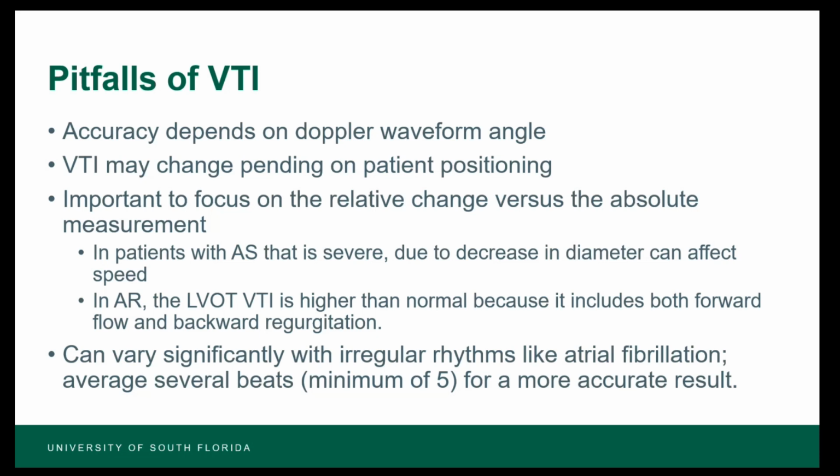It's also dependent on patient positioning. Now, that's less of an issue, given that a lot of the patients that you're going to be measuring this in are going to be critically ill patients, and you're trying to use this to guide fluid resuscitation. Those patients are often going to be ventilated, so they're usually going to be in a consistent position, and you're usually going to be collecting these in a relatively short period of time. And so that's typically not going to be an issue, but it's just something to be aware of.